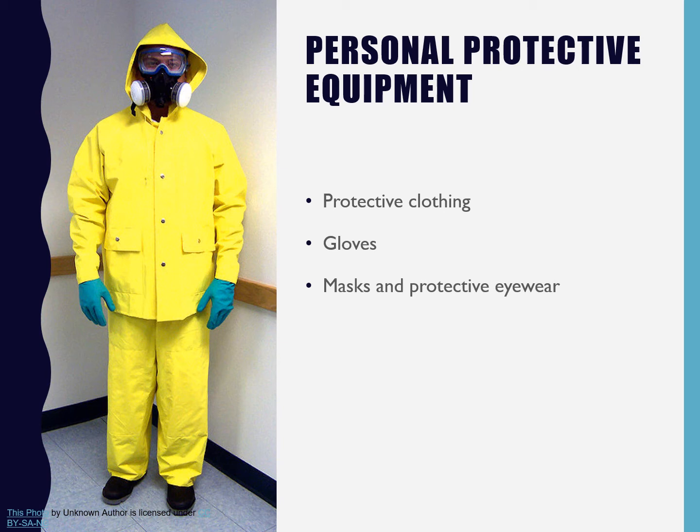Also, because of COVID, we do have to wear a face shield. Now, the face shield does not make up for the eyewear. If you're wearing a face shield, you don't have to have those side protectors with your glasses, but you do have to be wearing glasses. And then you have to wear either goggles or loops. And so you must wear something underneath your face shield.